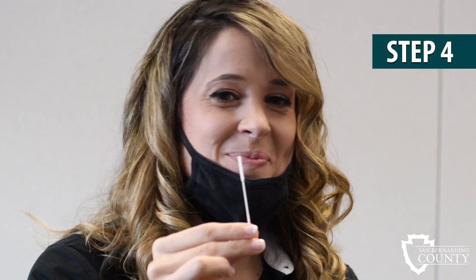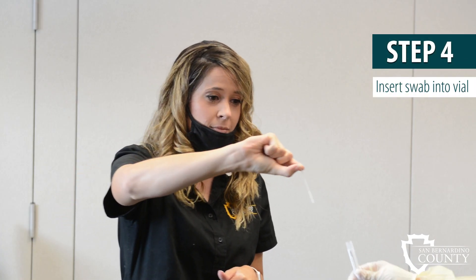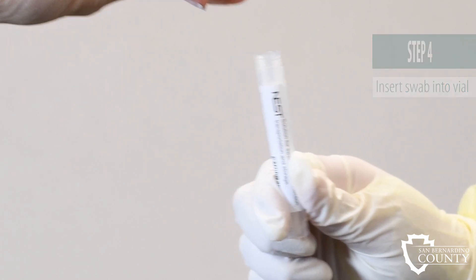Step 4: Insert the swab into the vial. Make sure to place the end of the swab that went into the nose into the vial first. Once you place your swab in the vial, you are finished with your COVID-19 test.